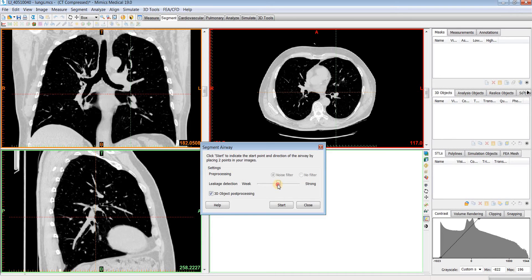Basically, the weaker we set this slider, the more branches the segmentation will find, but it will also result in more leakages that you'll have to manually delete. If we do the opposite and set it to a stronger setting, the branch segmentation won't go as deep, but we're a lot less likely to get those leakages. I'd recommend starting somewhere in the middle.